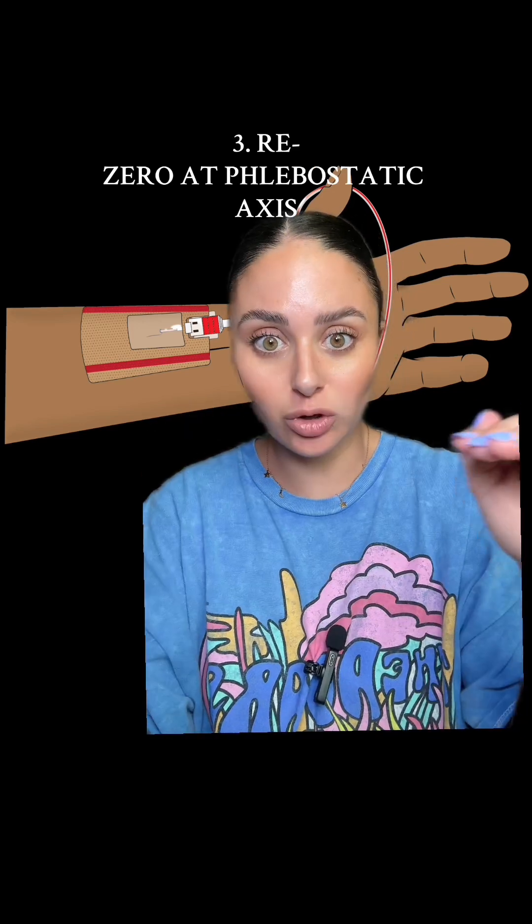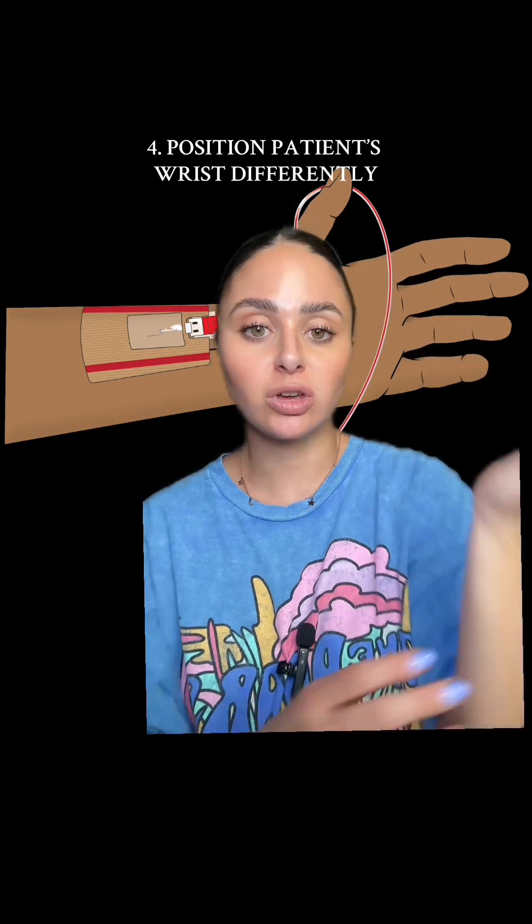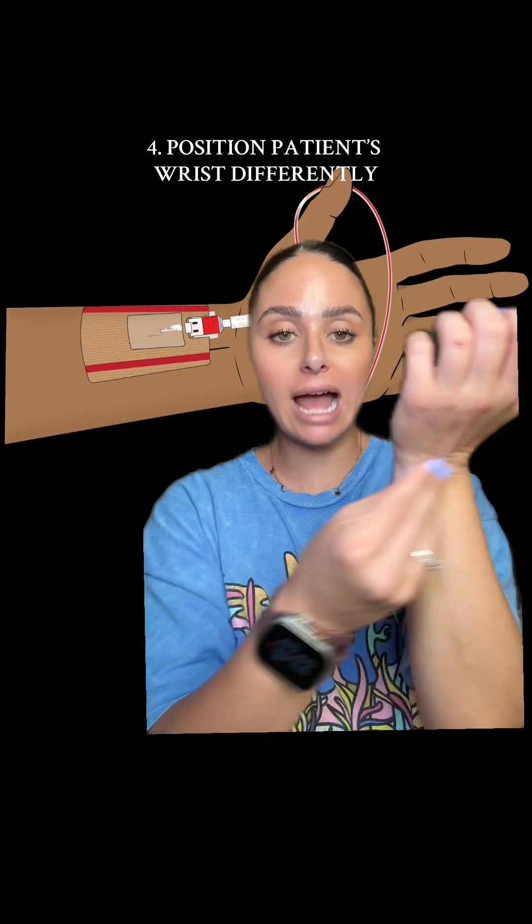Make sure your arterial line is leveled appropriately at the phlebostatic axis and zeroed on the monitor. Arterial lines are very positional — if your patient is moving their wrist around a lot, you're going to see your waveform get skewed. Sometimes you can get a little arm board or take a towel and wrap it under your patient's hand. Most of the time patients' arterial lines read better when the wrist is extended back versus being folded over.